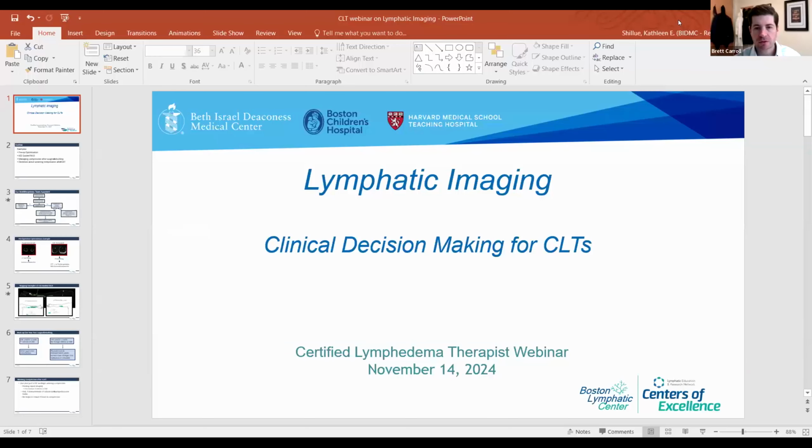So then Paul asked, does insurance cover imaging even if treated conservatively? It generally does, Paul. We use lymphoscintigraphy. I see patients as a vascular medicine doctor on the front end, so 90% of our patients don't get surgery. So we'll use lymphoscintigraphy if we're having trouble with the diagnosis, if there's not an obvious prior lymphatic insult, or if there's a question of primary lymphedema, just to really nail down the diagnosis. Or if they're having edema for unexplained reasons, we'll do it to see if there is a significant lymphatic component. It's almost always covered by insurance.